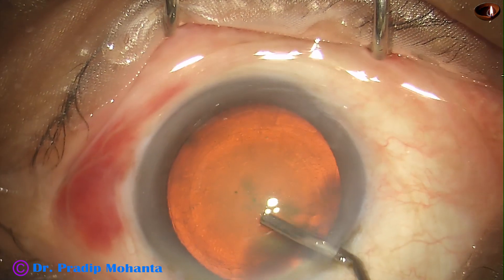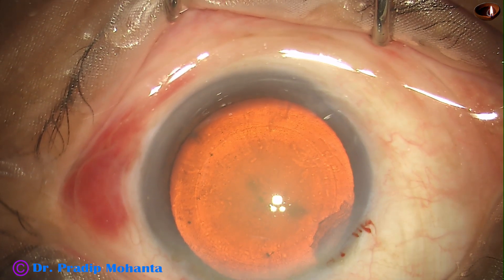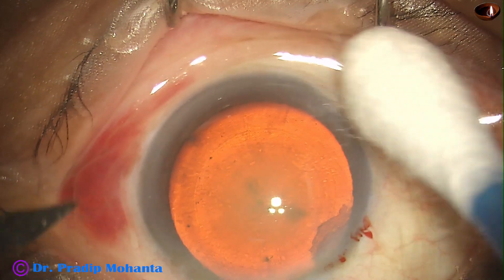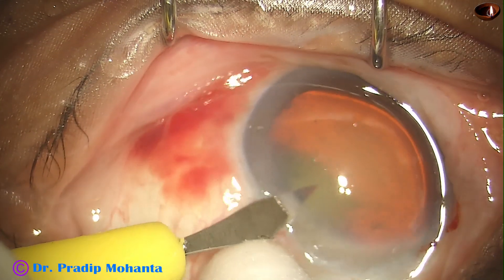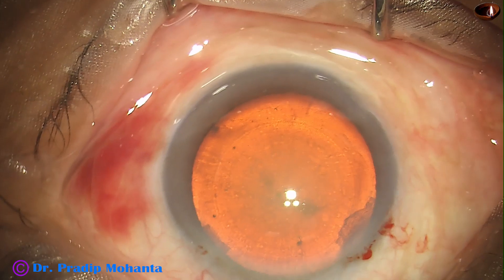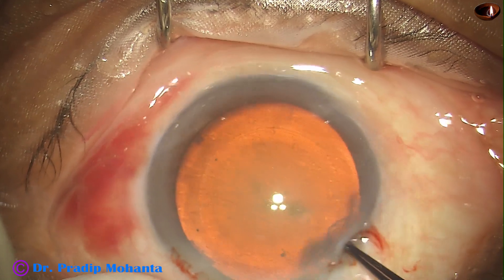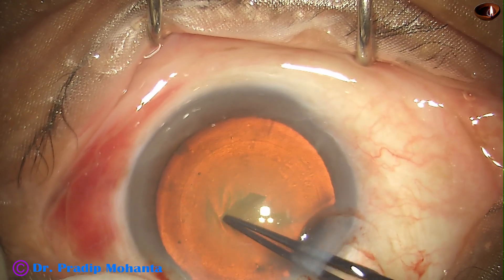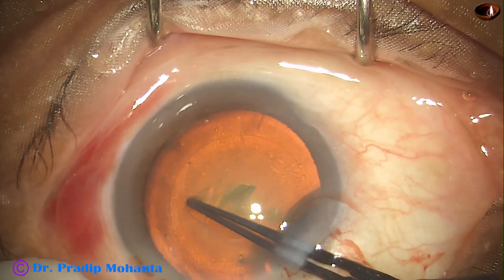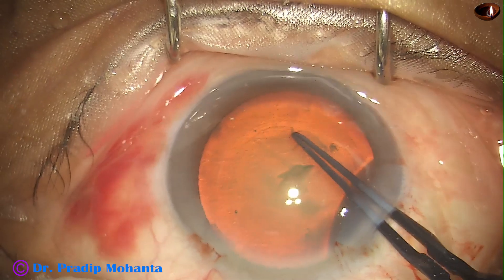See the beautiful red glow. The microscope is True Glow from Appa Sami Associates. It has oblique illumination as well as stereocoaxial illumination. The stereocoaxial illumination increases the depth perception to a great extent. In this case, we can see the nucleus and the epinucleus separately just by the red glow.